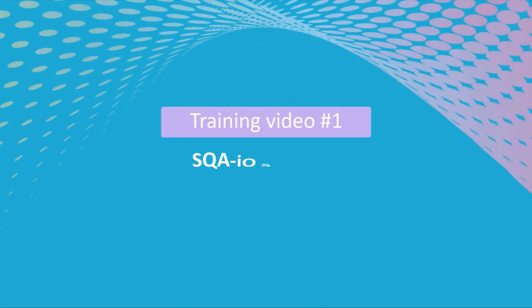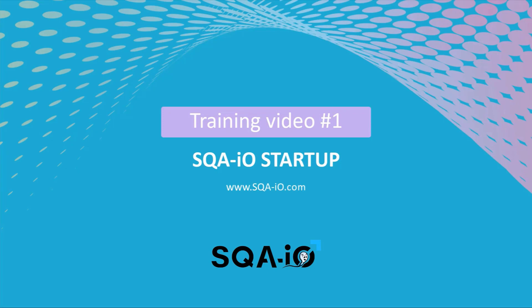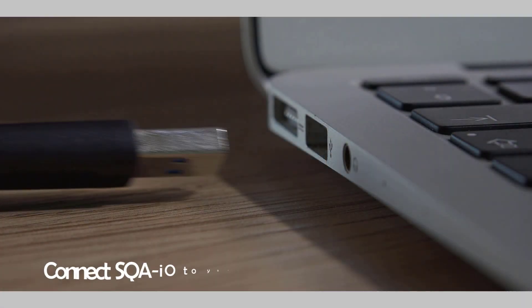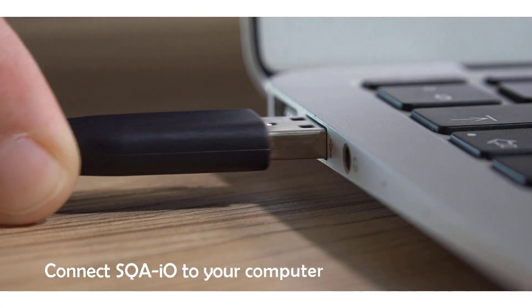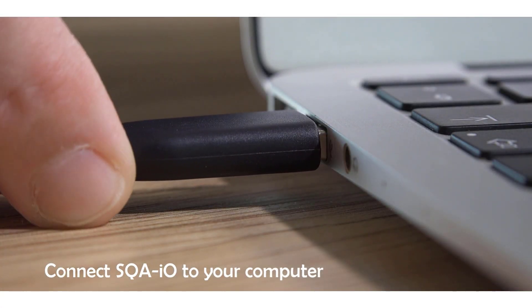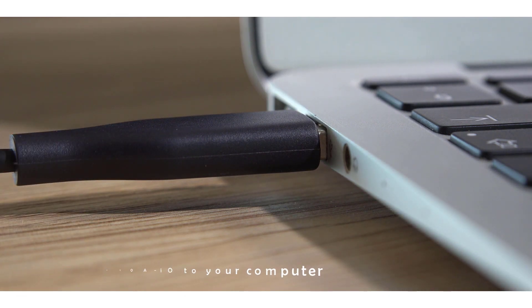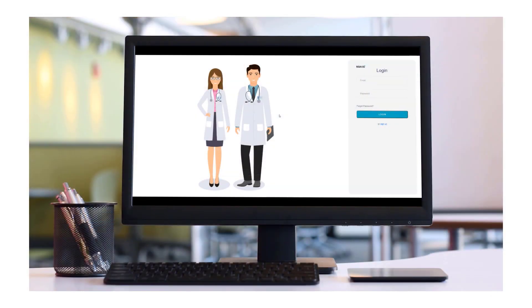Welcome to our SQA-IO startup training video. Your SQA-IO account should already be active before beginning training. Begin by connecting the SQA-IO device to your computer's USB port.